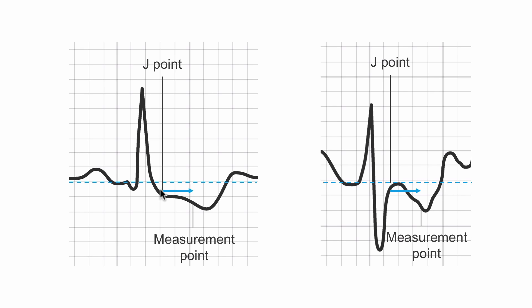Our J point isn't right on the line, so we start wherever the J point is and we go two little boxes over. That would put us here, and here is where we'd measure our ST segment depression.